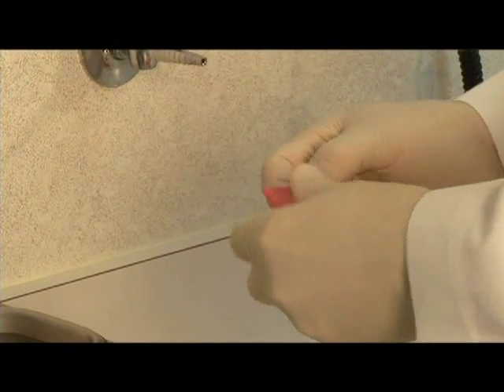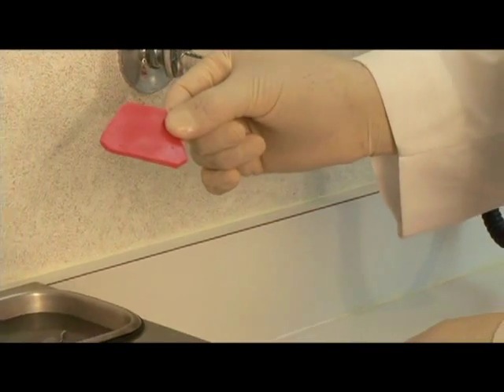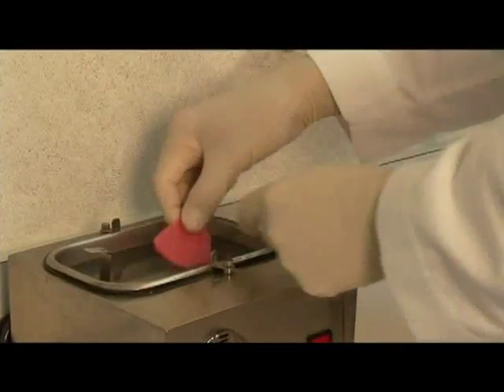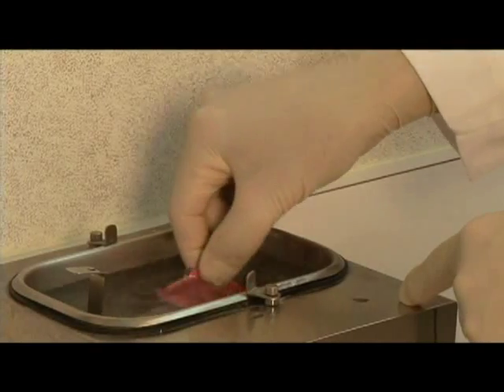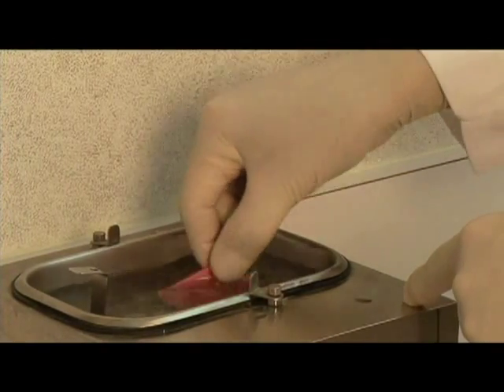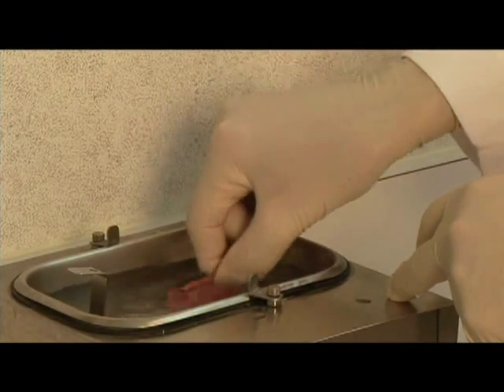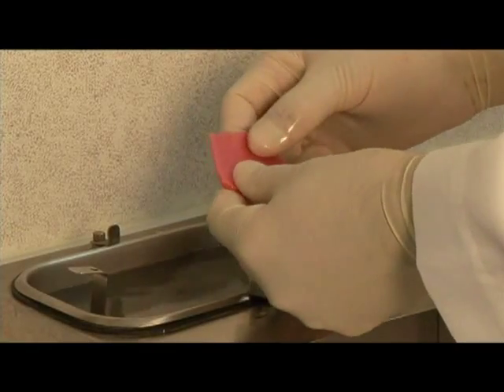Again, when we get ready to use this, we'll soften this wax to a uniform consistency, a dead soft consistency in the hot water bath. Again, knead the material as was described earlier when using the wax for the interocclusal record. And once it reaches its consistency, we're ready to go to the mouth to record the protrusive record.